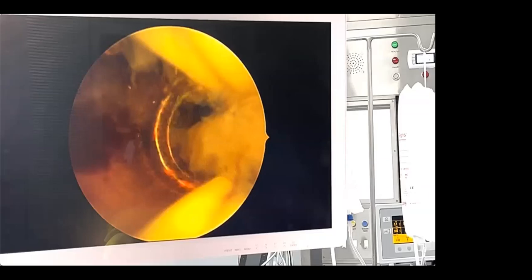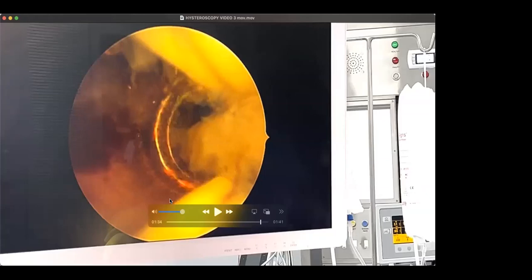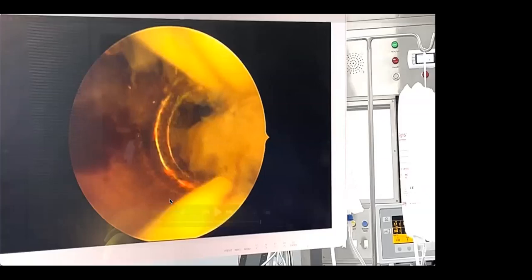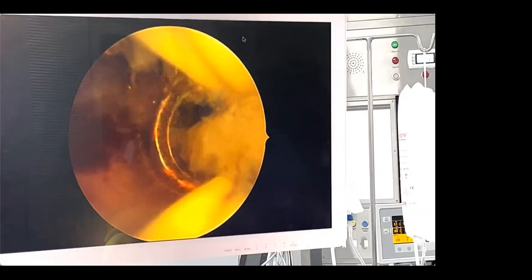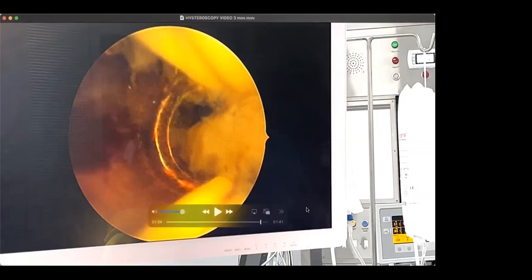Dr. Zeki, are you still there? I'm here. Yes, I think you should have also shown us while you are doing your hysteroscopies. I think you said you did that one a few days ago, isn't it? Yes, sir. I think you should have also shown us to see whether you were really in the uterus or you created a cavity. Yes, you're right.